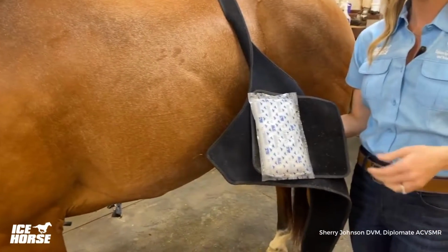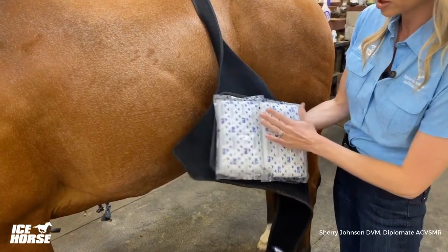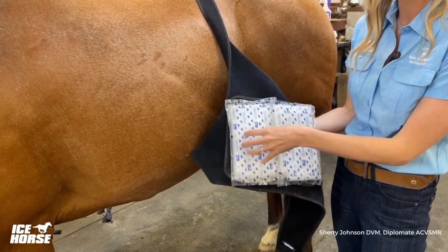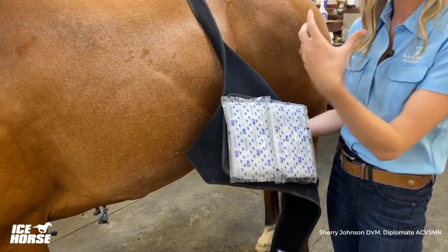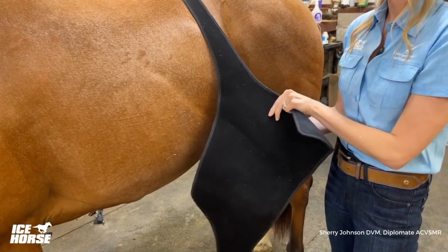So they're not going to be falling. It's not going to be awkward when you go to put it on the horse. And these landing strips are placed both for the medial femorotibial joint and also the femoropatellar joint. So that front joint, the inside joint, the ones that we're most worried about typically in injuries.